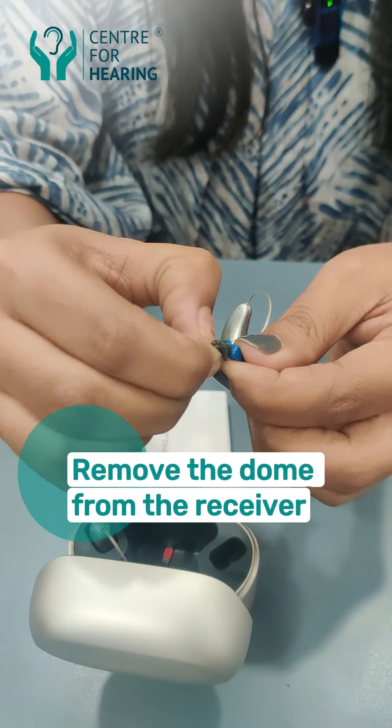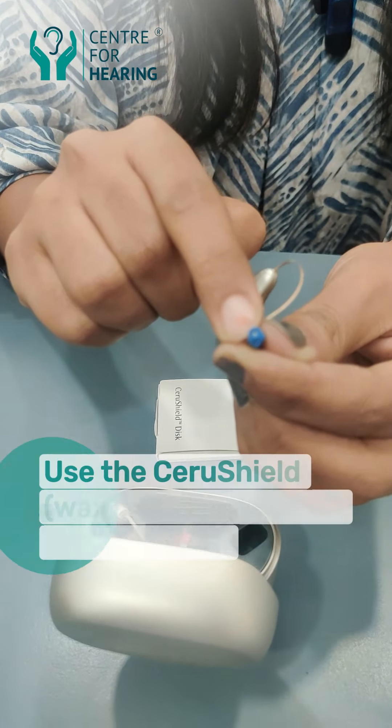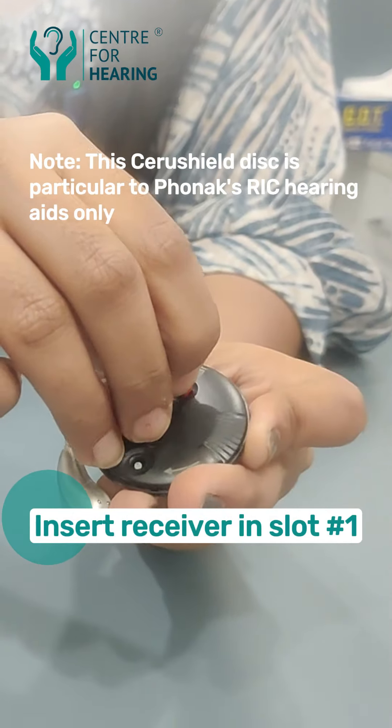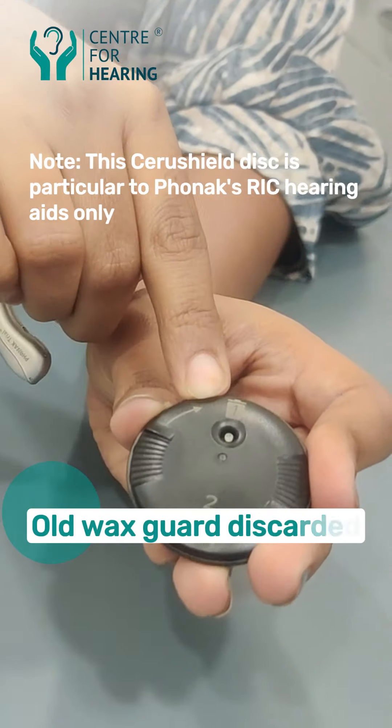If you put the dome out of it, it can block. In the hearing aid kit, you insert the receiver into number 1 and pull it out. This will remove your old wax guard.